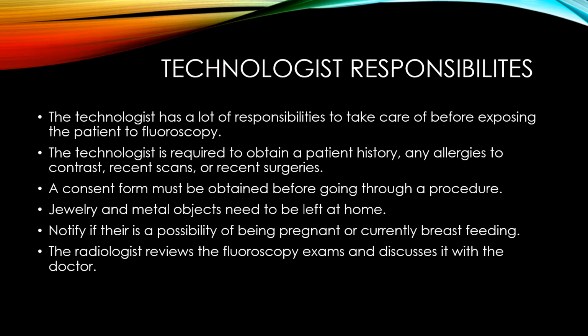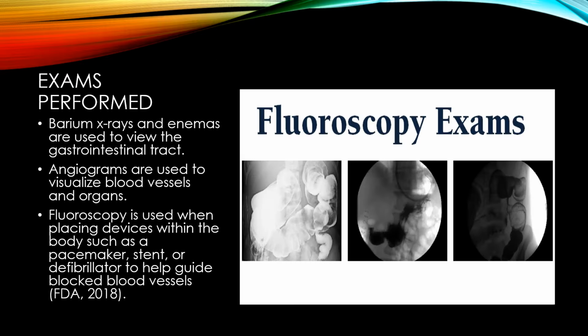At the end, the radiologist is the one who reviews the fluoroscopy exams and discusses it with the doctor.